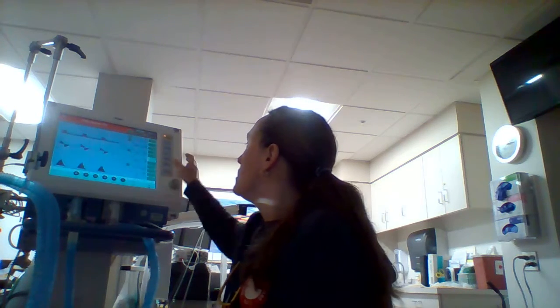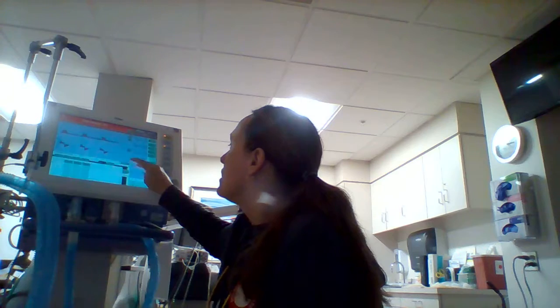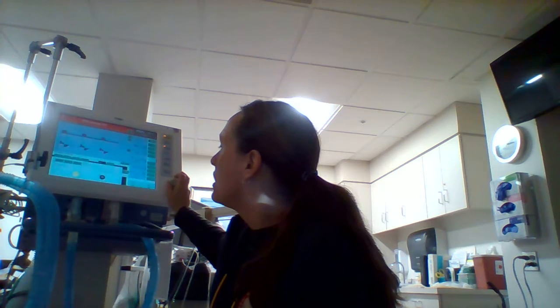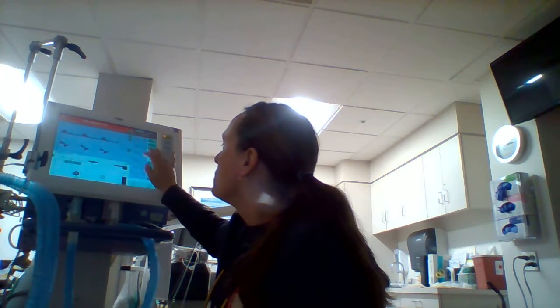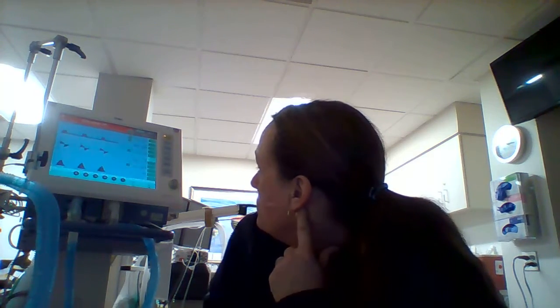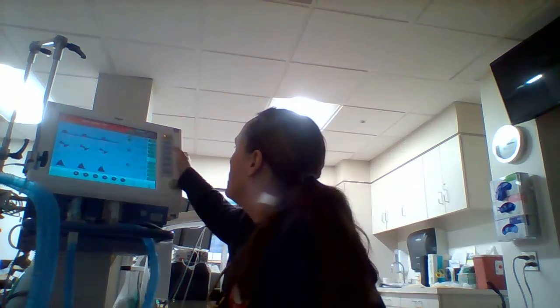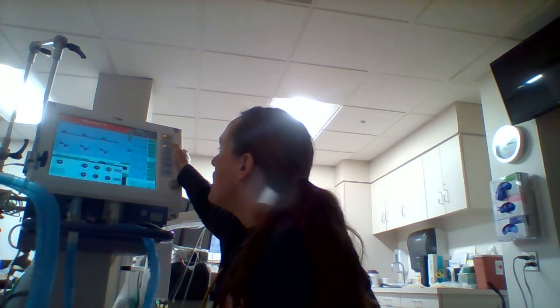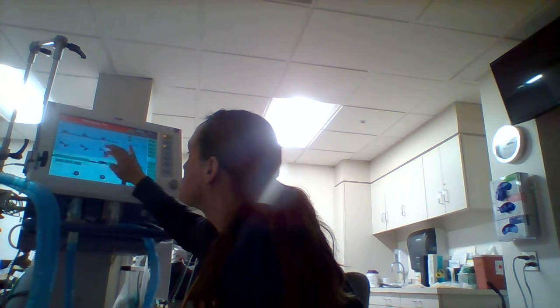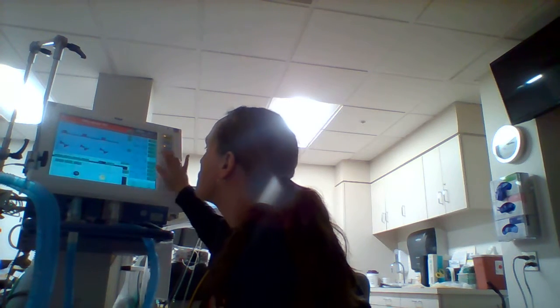That frequency of 14 with those settings works out nicely. For trigger sensitivity, it's set at 2, which would work, but I could make it easier and go to 1, or all the way to 0.3. I'll keep it easy. I also wanted to check whether a pressure trigger is available — yes, it is. Perfect, so that covers all the settings.